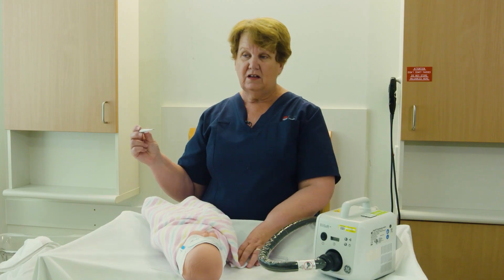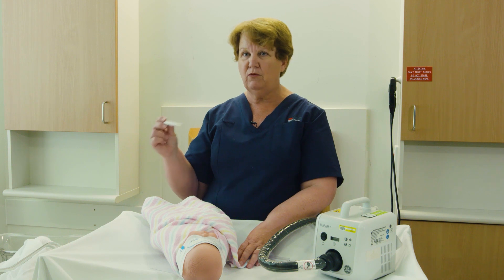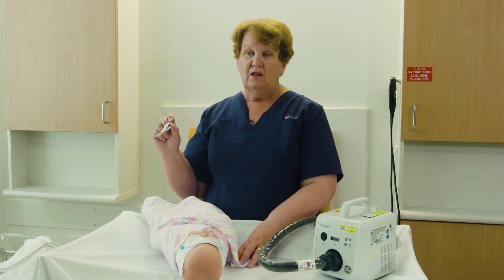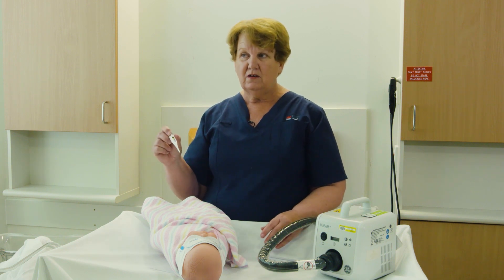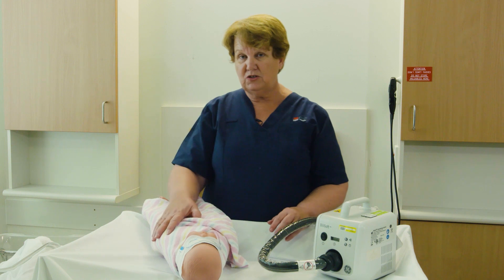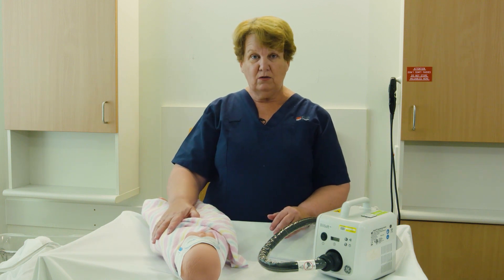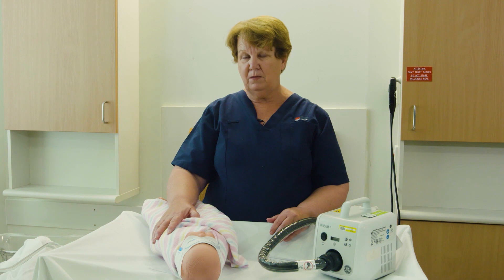The temperature ideally should be between 36.4 and 37.4. If the temperature is too cold, you may need to warm the environment up by putting a heater on, remove draughts, feed the baby, and check the baby's temperature within an hour's time. If the temperature remains cold, you may need to strip the baby down and do skin-to-skin with your infant to try and warm the baby up.